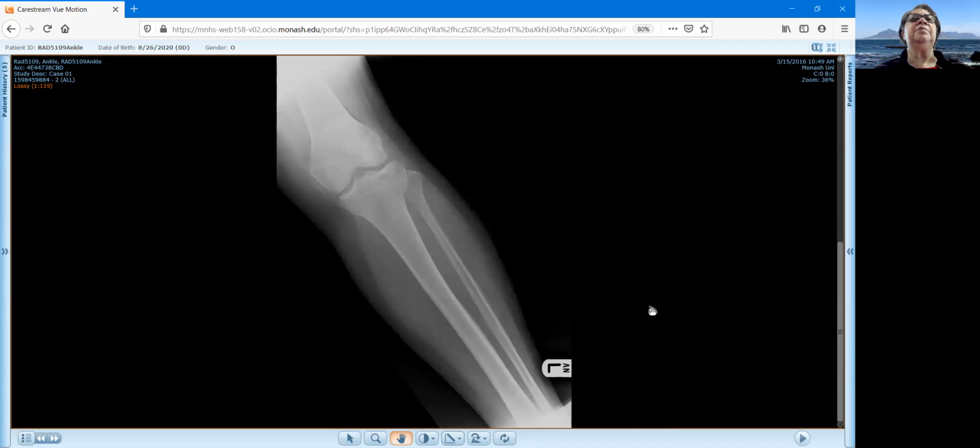This presentation will focus on the ankle and lower leg feedback. Please have your opinion form at hand so that you can self-mark as we go along.